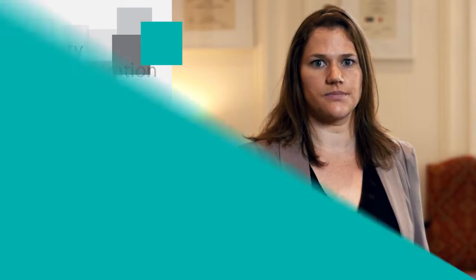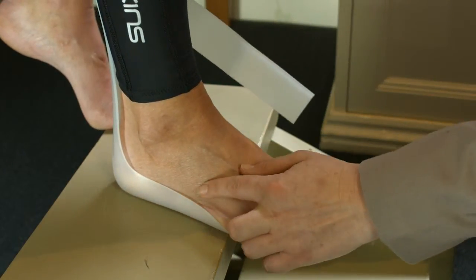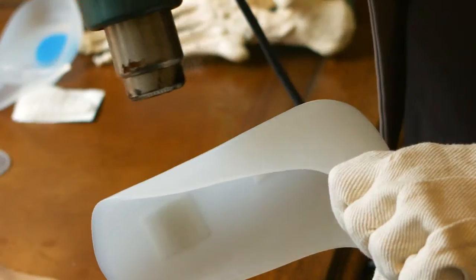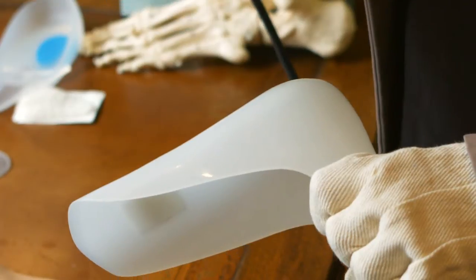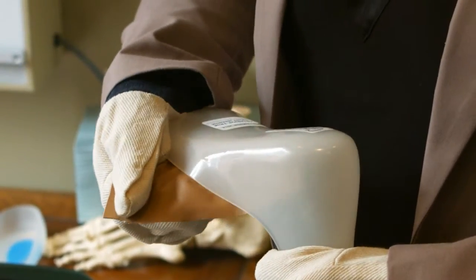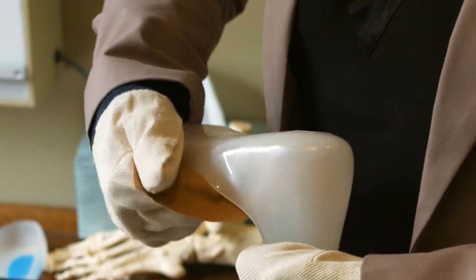To relieve pressure on the base of the fifth metatarsal, heat until the plastic starts to become transparent. Apply pressure with a rounded surface covered with leather. You can cool with water if required.